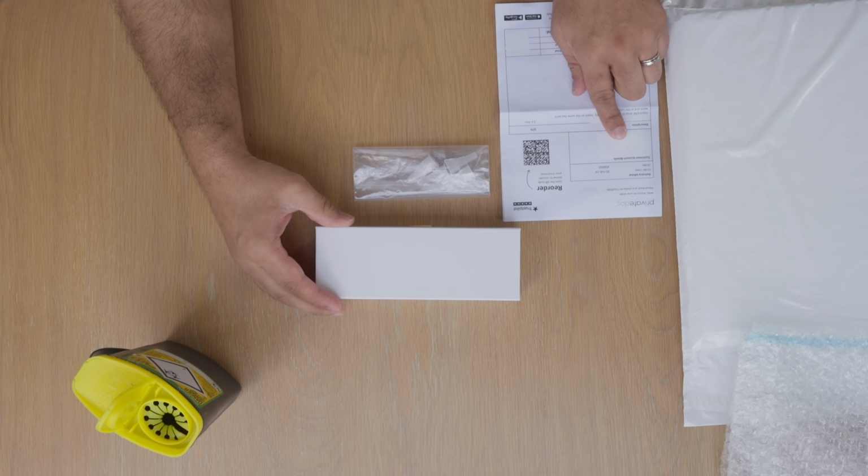Please be aware, for the purposes of this video, we are using a demo pen. Your pen will look slightly different. Before you get started, check that the details on the prescription are correct.